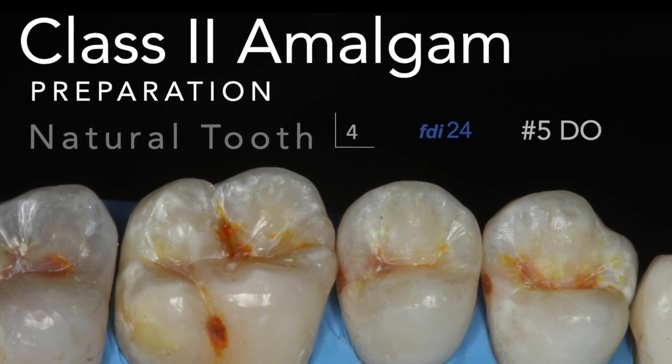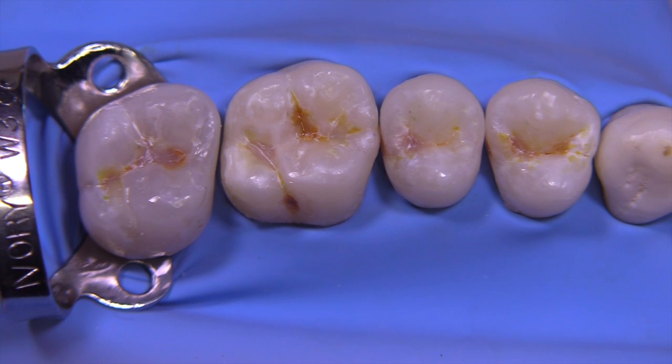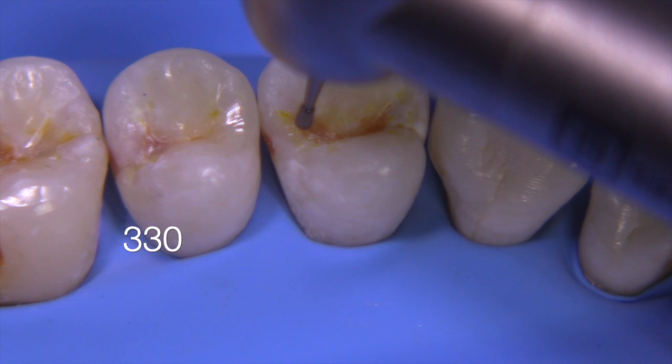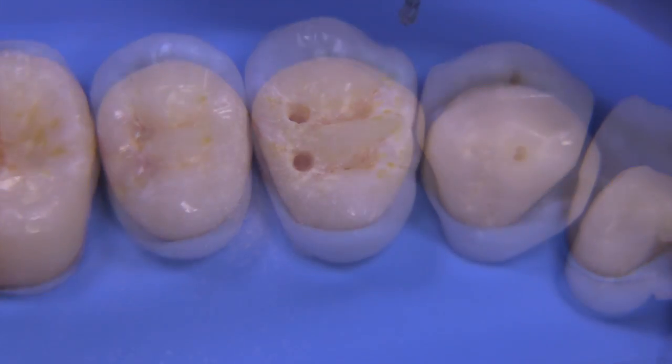We're going to prepare this quadrant with direct restorations and then eventually convert it over to indirect restorations. It's going to be a lot of fun. I've taken some teeth and mounted them in a typodon and I've created some artificial caries.